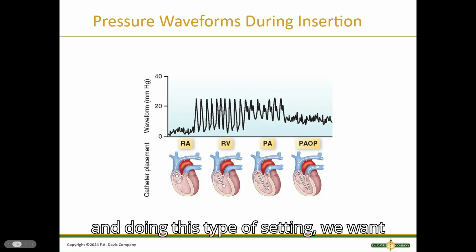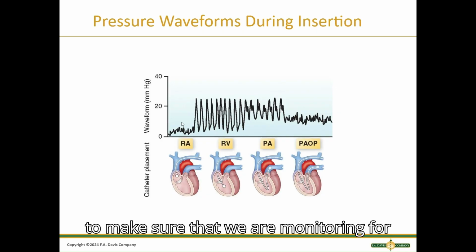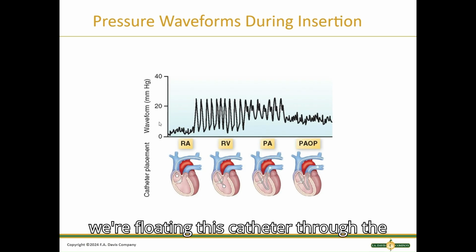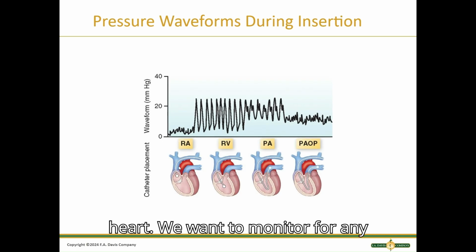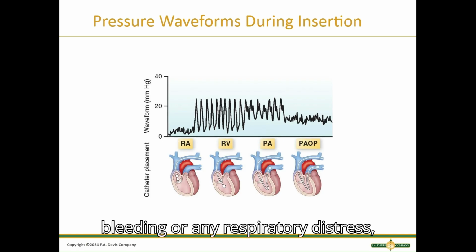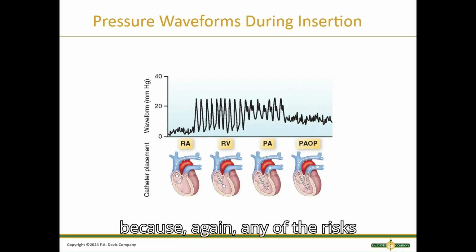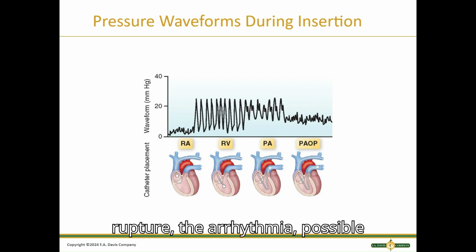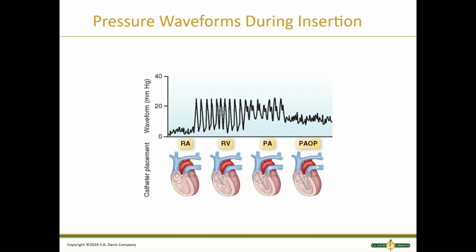So this is just a picture showing you kind of what you would be seeing on the measurements if you were doing this, say, in a catheter as you're looking at it. As the pulmonary artery catheter goes into your right atrium, you're going to see your CVP. CVP, again, that's your filling pressures, your preload, right atrium. Those measurements are anywhere between 2 and 6.